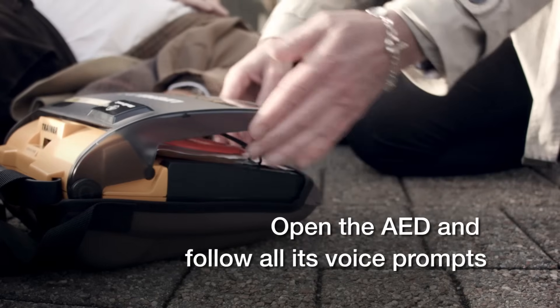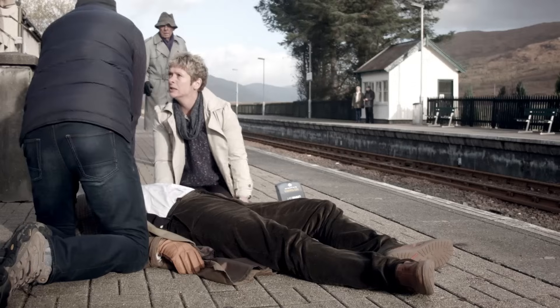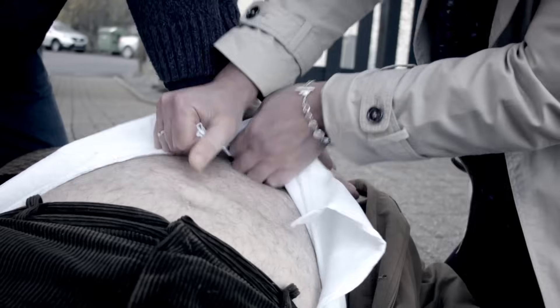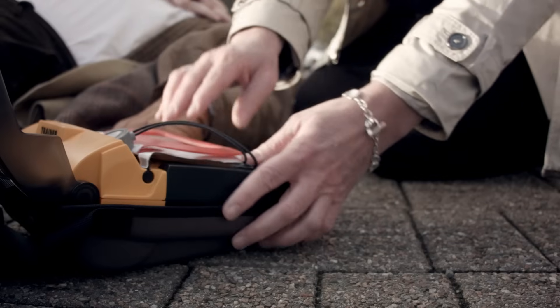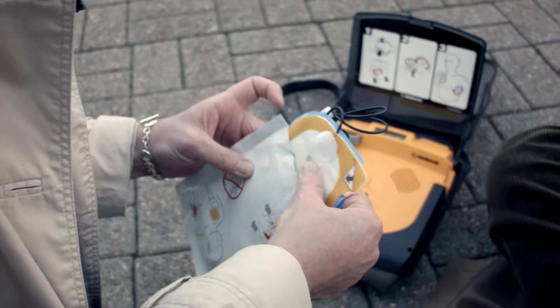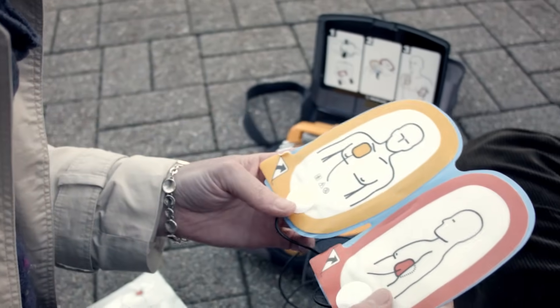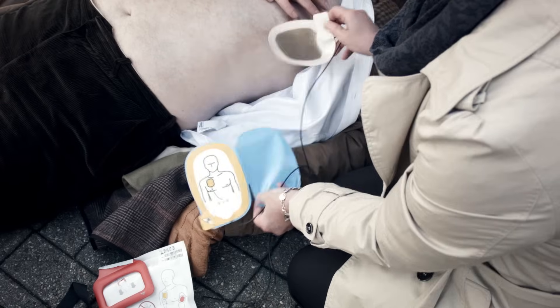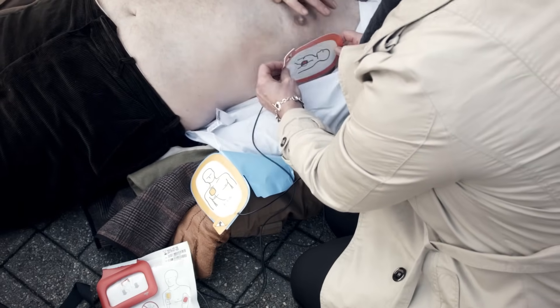Quick, open it. Call for help now. He just collapsed. Remove all clothing from patient's chest. Pull red handles to open bags. Look at pictures on pads. Peel one pad off blue plastic. Apply pad to bare skin. Bare skin. Press firmly.